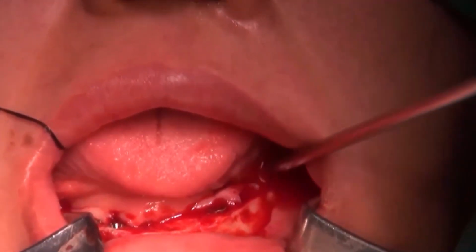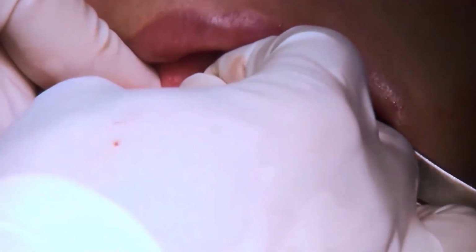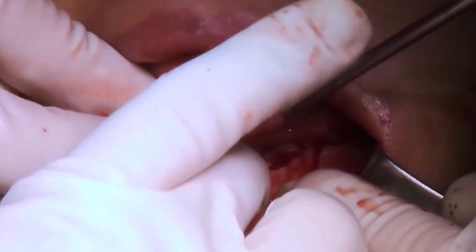All implants were placed precisely within the alveolus. And then straight abutments are connected to the implants.